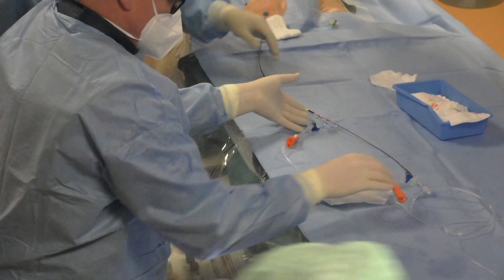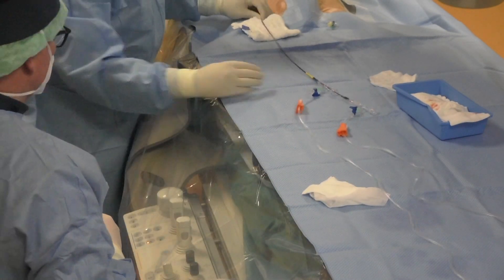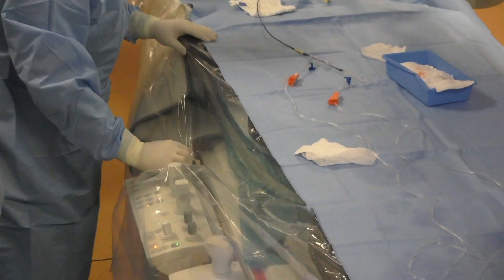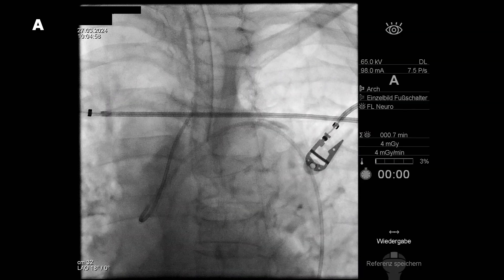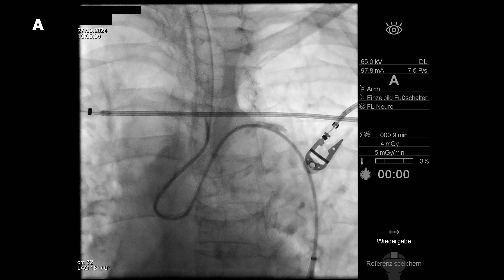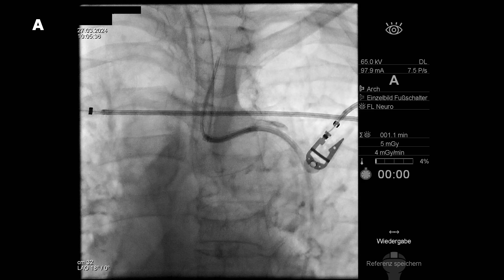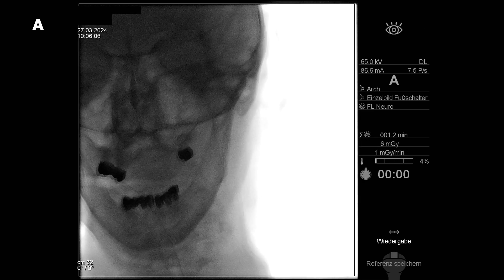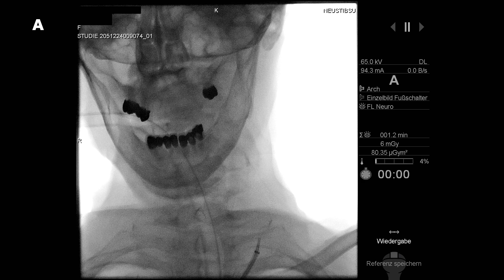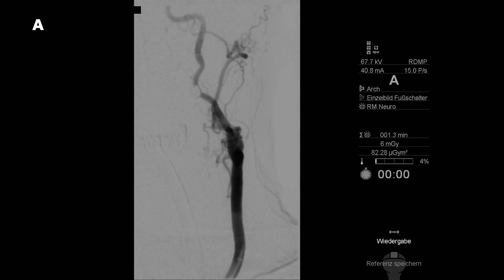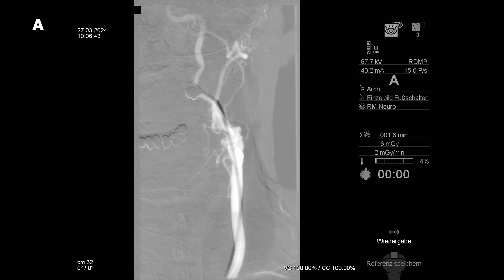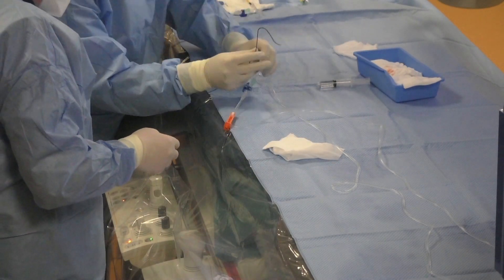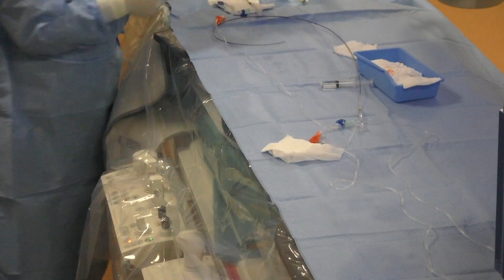We insert the long sheath NeuronMax with the Penumbra Select catheter into the short femoral sheath. We move the angio table to see the aortic arch. The Penumbra Select catheter is already configured and we navigate to the left common carotid artery. Now we're pushing the NeuronMax long sheath a little bit distally. We make a roadmap to see the anatomy, then push the Penumbra Select catheter into the internal carotid artery along with the long sheath NeuronMax.